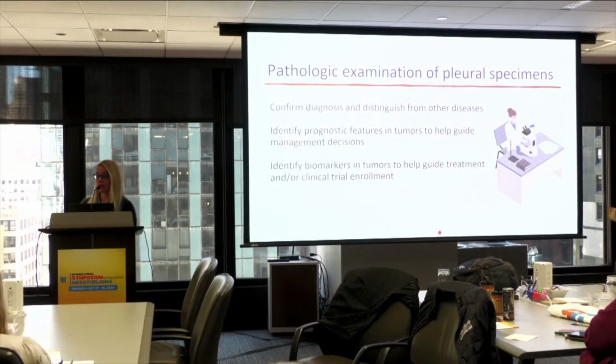Yeah, so in our institution, about 30% of our patients have a diagnosis elsewhere before they come to us. But before our clinicians will treat the patients, they need to have MSK pathology review the slides. So the standard procedure is to have the slides come to us, we review them, and then we do send them back. We also digitally scan them before we send them back, so we have a record of those slides.